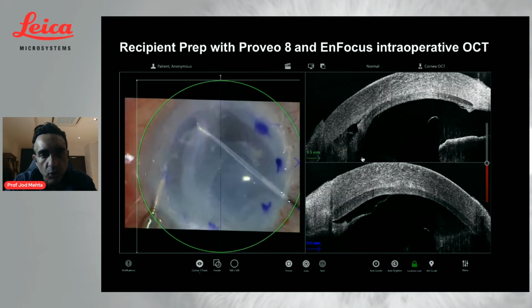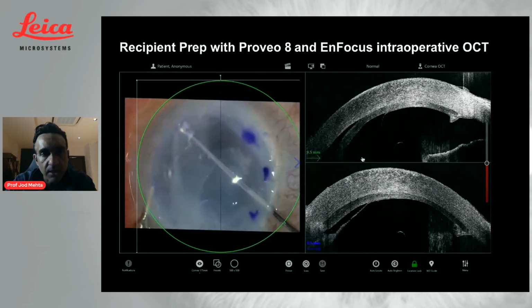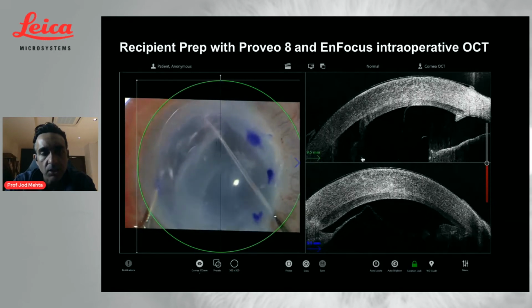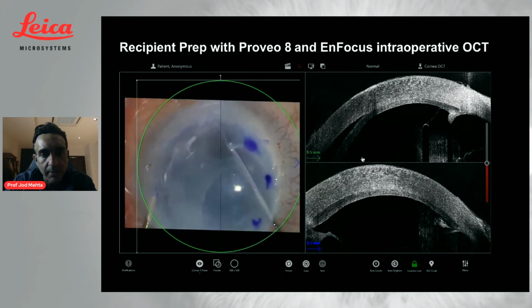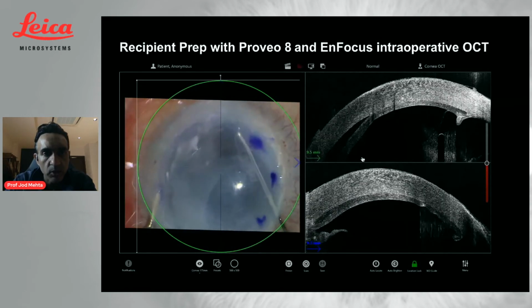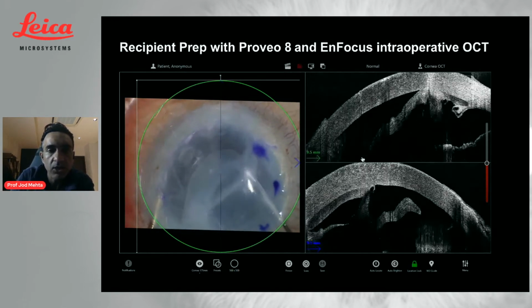Now I'm starting to coil away the previous DSEC tissue, and we often see this when I'm doing these redo cases, where I'm taking out the DSECs and replacing them with DMEKs, especially if they're slightly larger DSECs, because typically in DSEC, the peripheral part of the graft is thicker than the central area, and often you can get PAS around the margins over here. And being able to visualize this when you're doing the surgery can help you get your edge itself, and also reduce the amount of trauma you get around the iris.